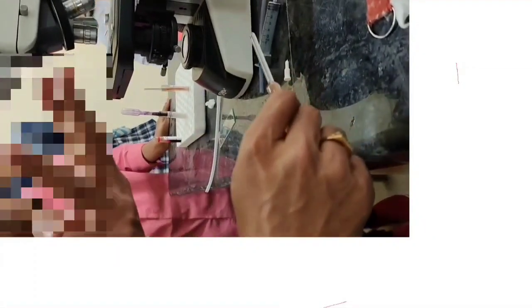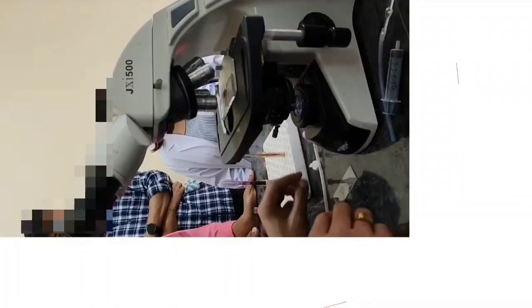So now I am going to mix it. Everything is ready. Up to 101, blood is there. In the stem part we have only fluid, and the blood is already pushed towards the bulb. In the bulb we have blood as well as fluid, and in the stem part we have only fluid. So you should keep that in mind. The red bead will actually help you to mix the blood with the fluid.